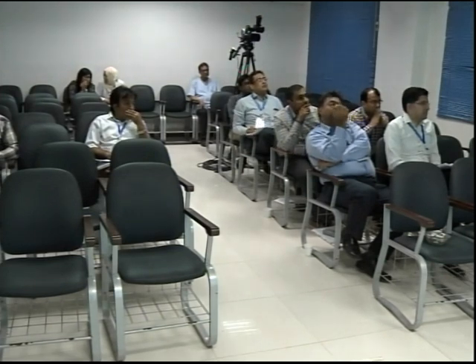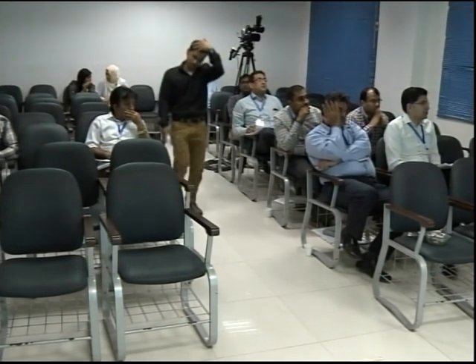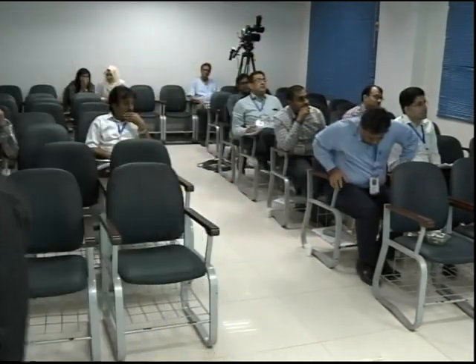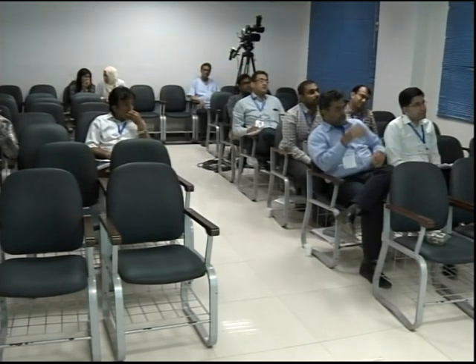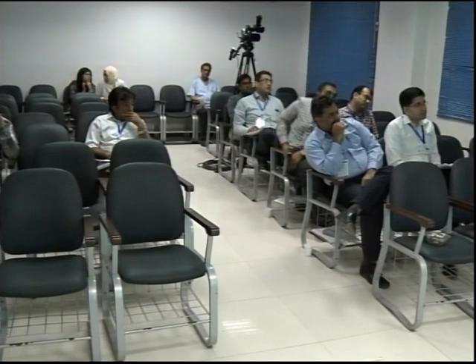मतलब choice होती है patient की. और अगर आपका technique अच्छा हो तो you don't need even minimal sedation. Uppers again we do patient choice, but most of them I do without sedation, and then you can go straight to the floor. Colonoscopy, ERCP I always give sedation, because in that I think the patient will be much calmer.